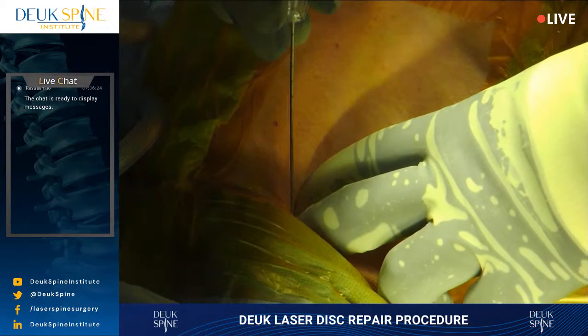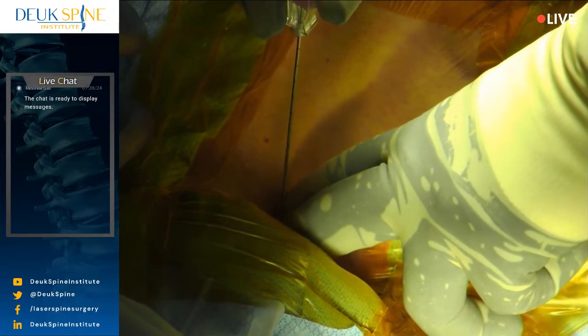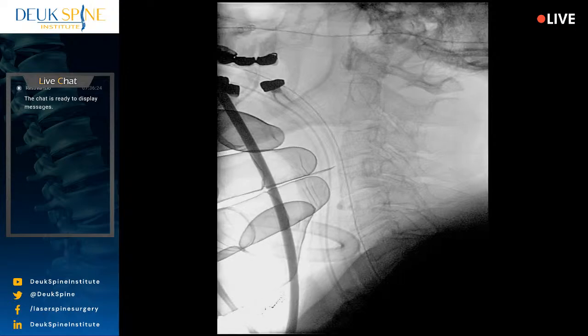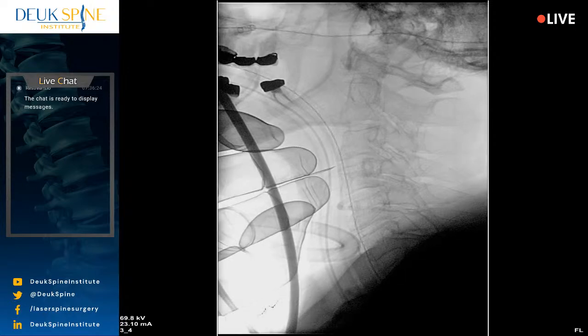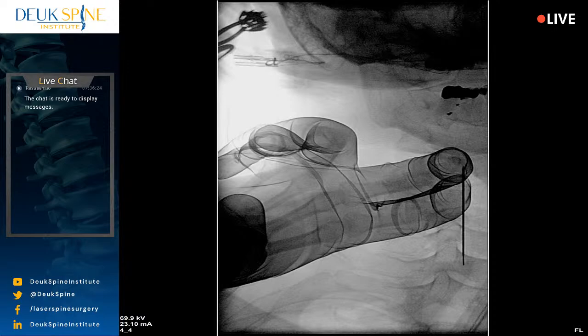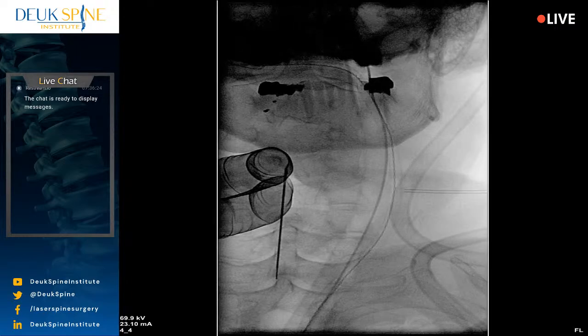All right. So we're going to use our fluoro shot. Shot. Shot. AP quick. Stay where you are, doctor. I'm almost done. Give me a quick AP now. Please, I need you to be on target. All right, so the neck has moved way too much, and you're way rotated. This should be there. No, other way. Shot. All right, let's go back to a lateral now.